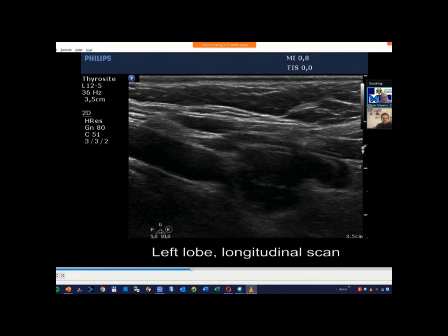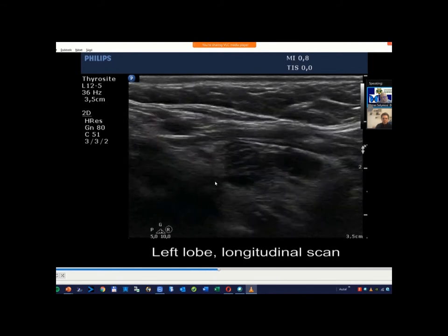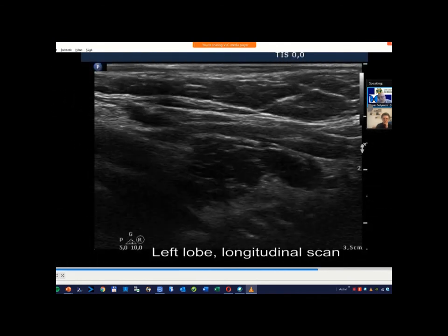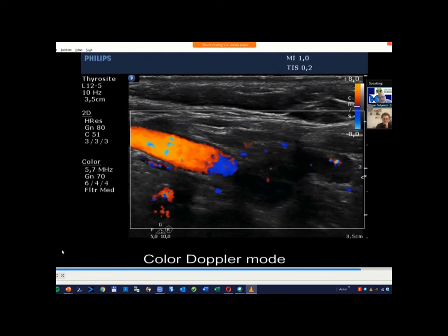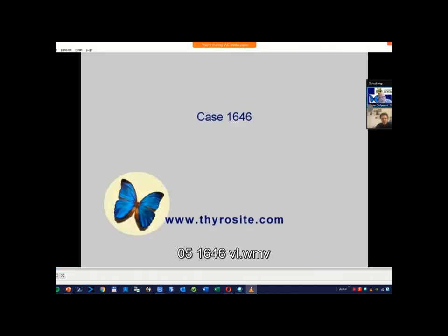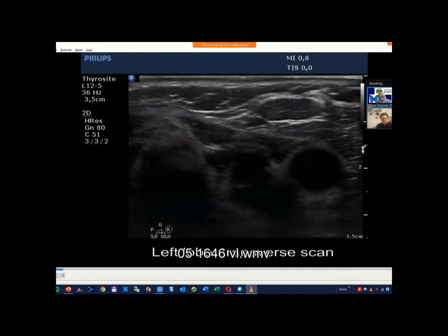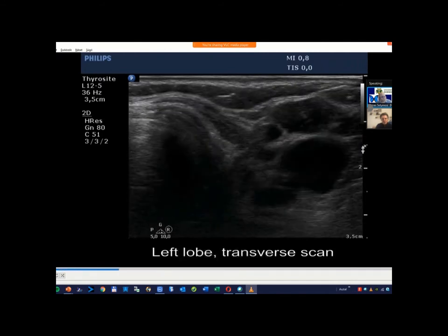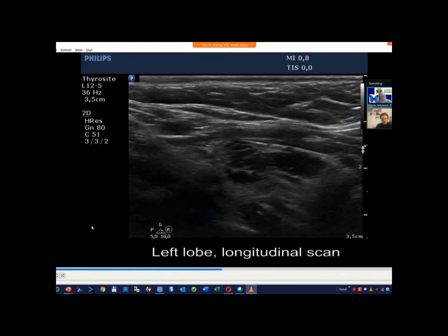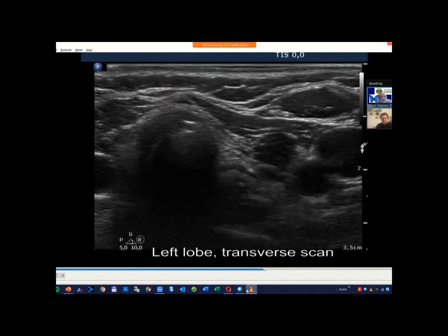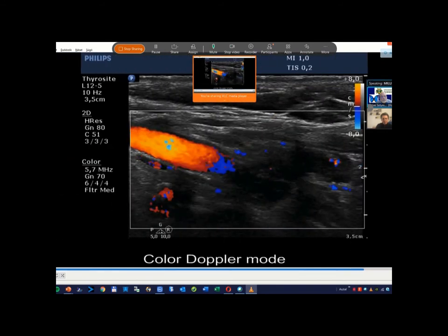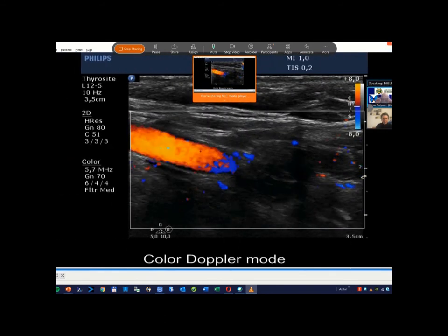It is very typical that discrete lesions of Hashimoto's thyroiditis present intralesional connective tissue. In a true nodule, it is very rare for connective tissue proliferation to be present. However, in Hashimoto's thyroiditis lesions, we frequently find this intralesional connective tissue.